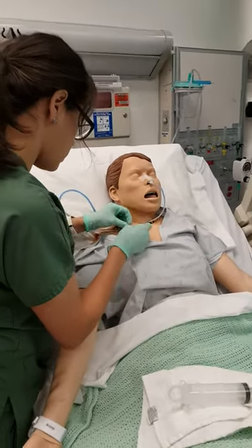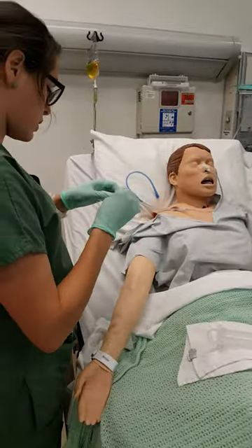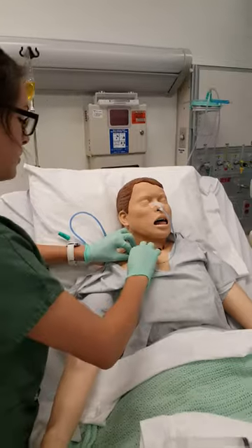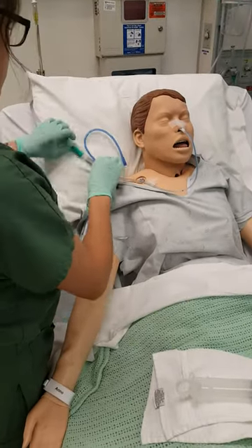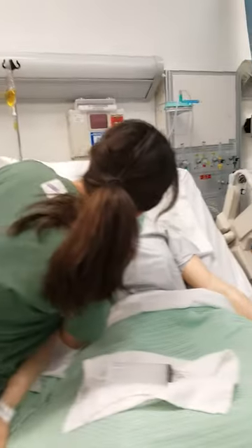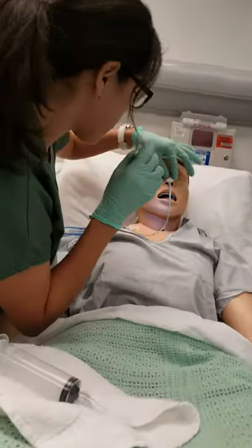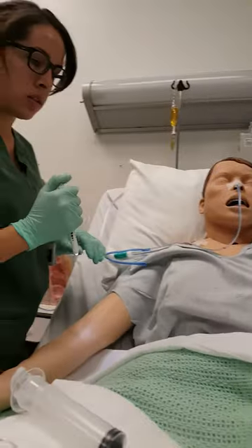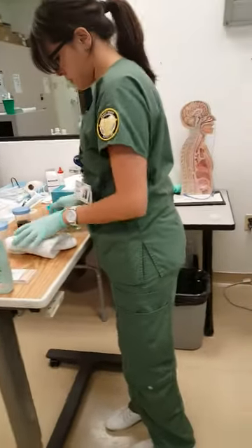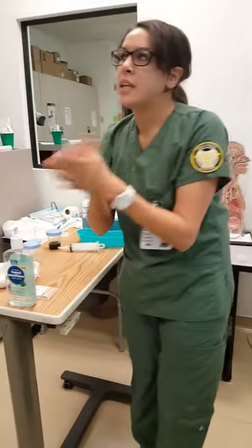I'm gonna attach this back over here. I'm sorry about this tape too — it's just not that good with your skin. So I'm just gonna check again, make sure that the surrounding skin is okay. Do you have any discomfort or pain? No, it's fine. Okay, it's still in the right location. And then I'm gonna dispose of that and my gloves.